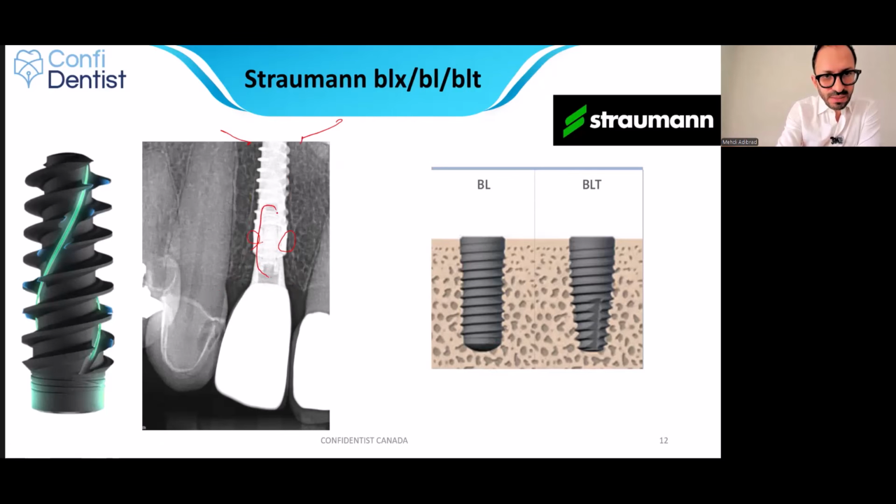Look at the prosthetic screw. So this is the prosthetic screw. And this is the prosthetic abutment attached to the crown. So this is the case that we used a screw retained crown. This is the prosthetic screw, okay? Sitting inside the implant fixture. A PFM crown and an all ceramic Emax crown, and this one, okay?